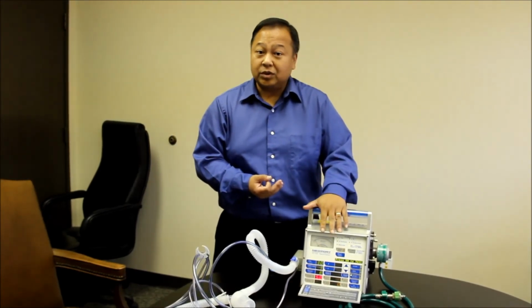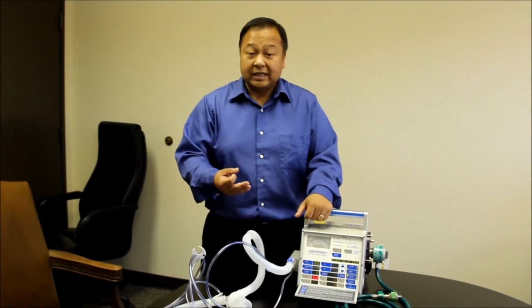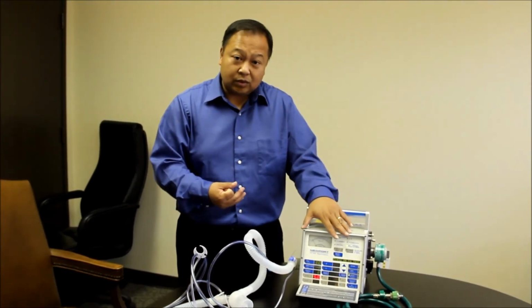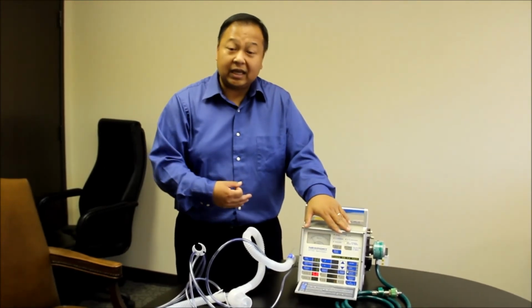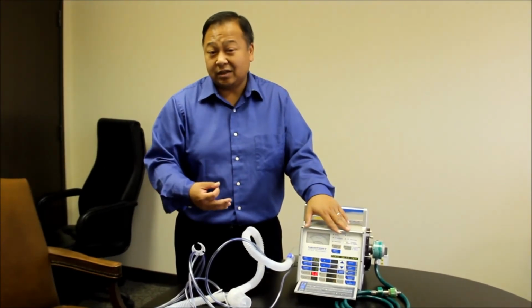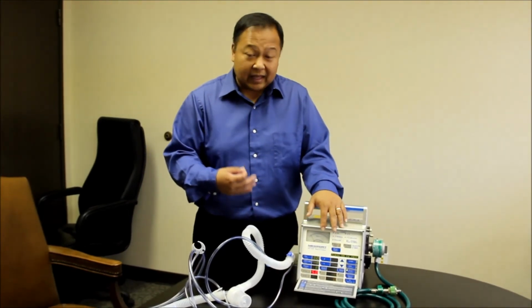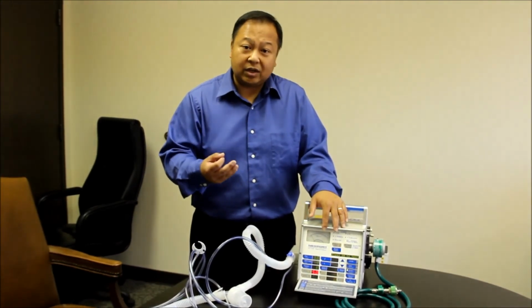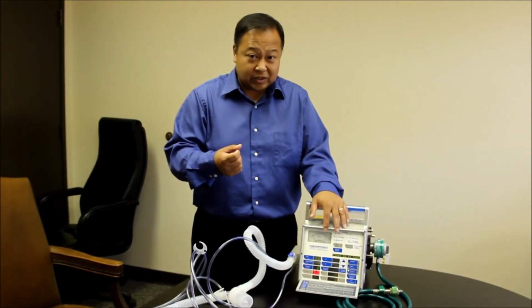If the patient is able to cough, that's a good sign because that will allow them to cough when they get extubated. For taking in a deep breath, this ventilator will measure the volume that the patient has by taking a deep breath. If a patient can breathe in about a liter of volume, that means they're pretty much ready. And the last thing we're going to check is what's called the negative inspiratory force. That's pretty much the sucking power that the patients have.